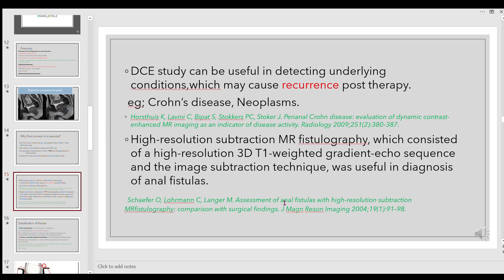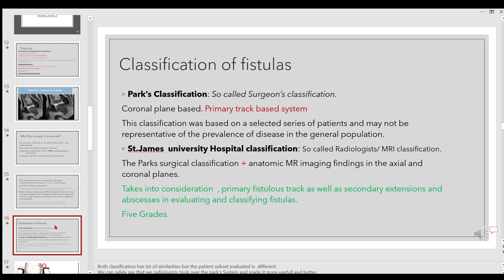Dynamic contrast enhancement can be useful in detecting underlying conditions causing recurrence post-therapy. This is taken from a Radiology article originally for Crohn's disease, but applicable to malignancies as well. Another application is 3D T1-weighted fat-suppressed gradient echo sequences with subtraction for MR fistulography — producing a track-alone picture giving a good 3D resolution. However, this is not widely practiced today because conventional T2 and T1 protocols have advanced considerably compared to the last decade.